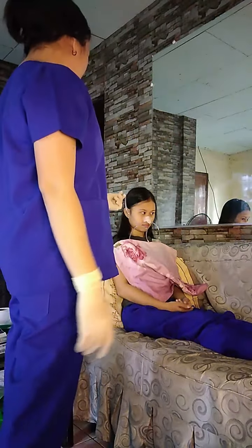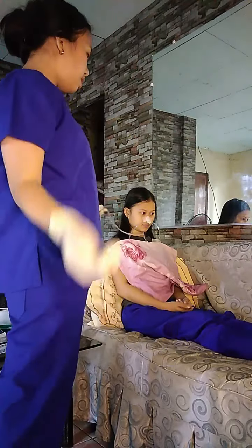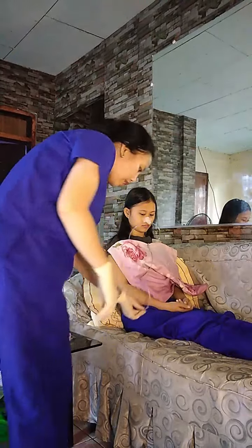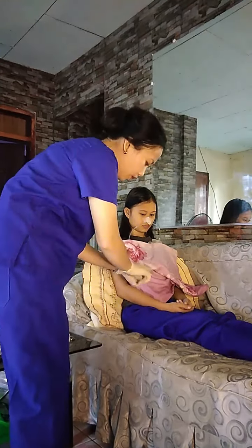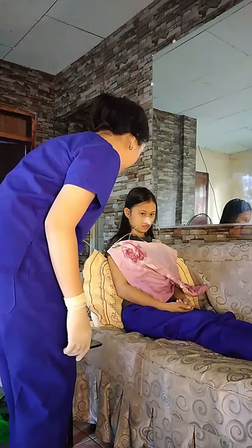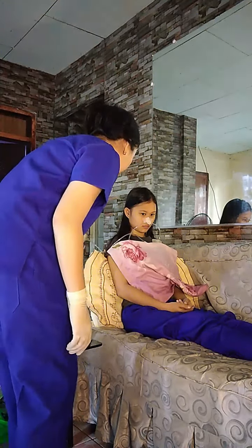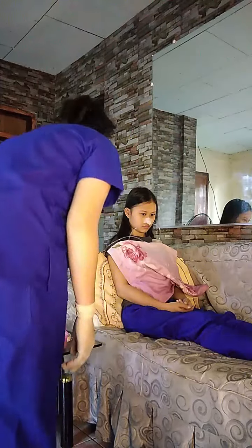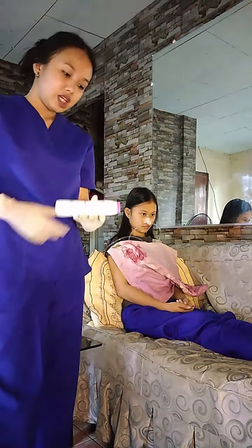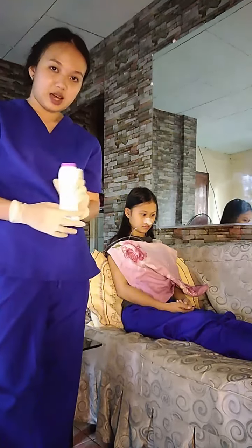So, ang una kong gagawin is, ika-clamp ko muna, assuming na naka-clamp na muna yung tubing. I-let go ko muna siya sa may likod ng pillow ng patient. And then, kukunin ko na yung formula na i-feed natin sa patient.